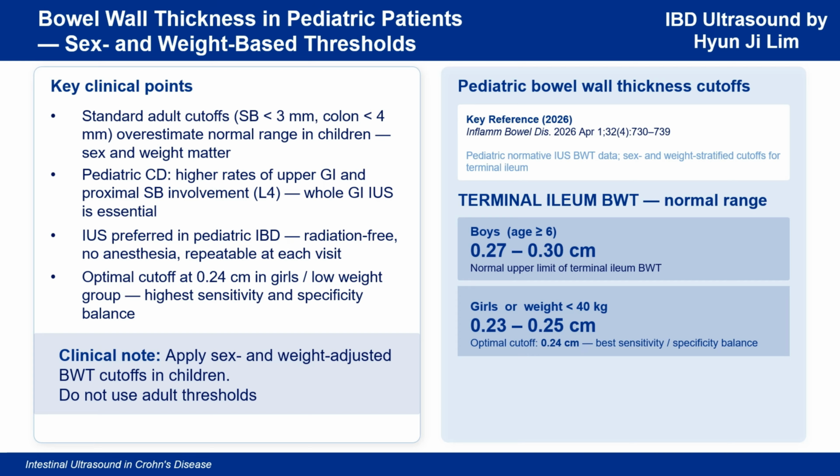IUS is the preferred imaging modality in pediatric IBD precisely because it is radiation-free, requires no sedation, and can be repeated at every clinical visit to monitor disease activity.